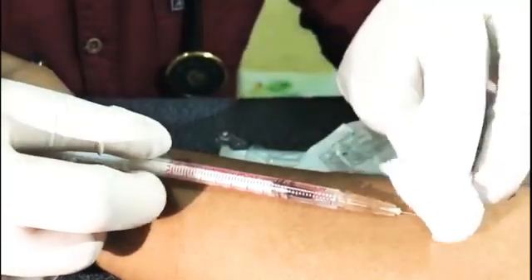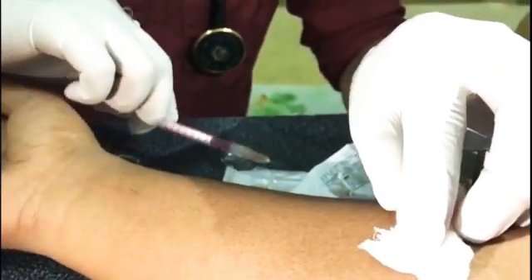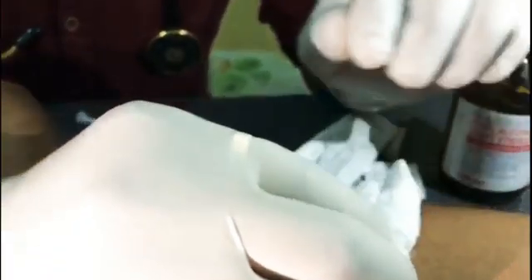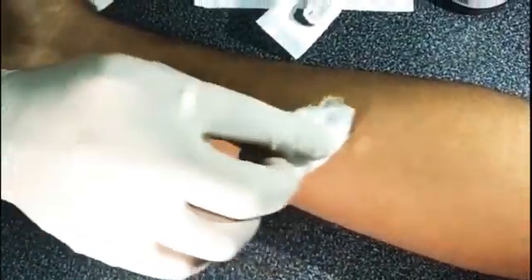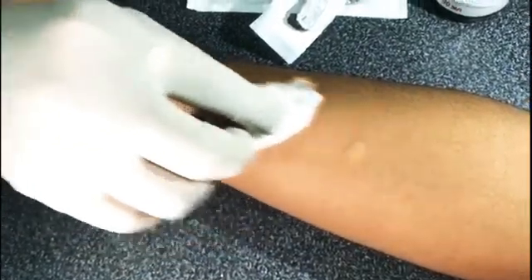Use the cotton, gently remove it. The main instruction is: do not rub the site — leave the site as it is. If possible, mark the site with a pen.